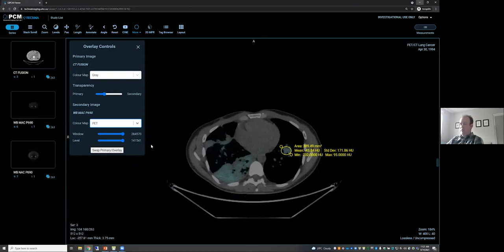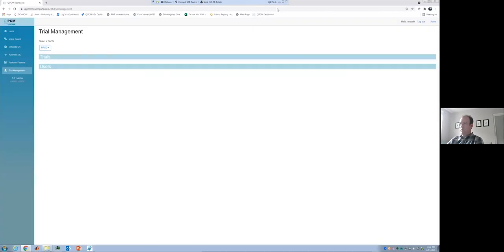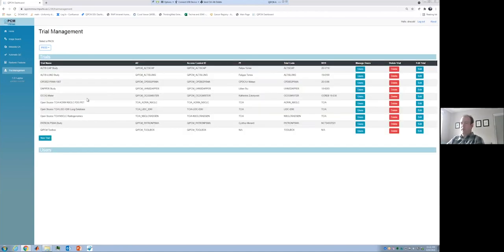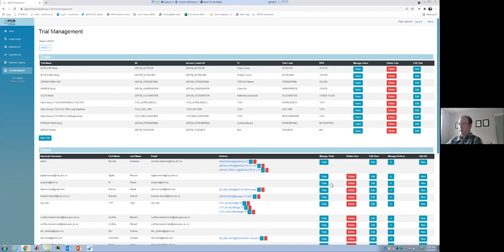The other thing I'll briefly show is our trial management UI. We have a UI that makes it really easy for anyone on our team to manage these trials — we can see the different trials listed and what users have access to them, and vice versa. We can see the different users and add different trials to a user. This UI is making all the changes on the back end in both Keycloak and our PACS, and it's making our lives much easier for all the trialists working under us.